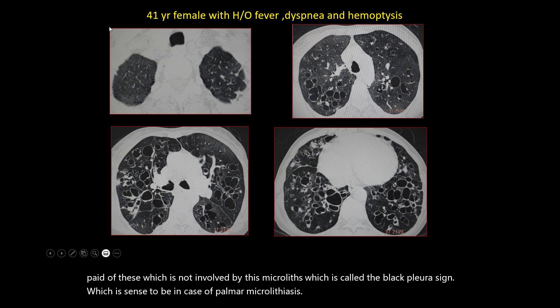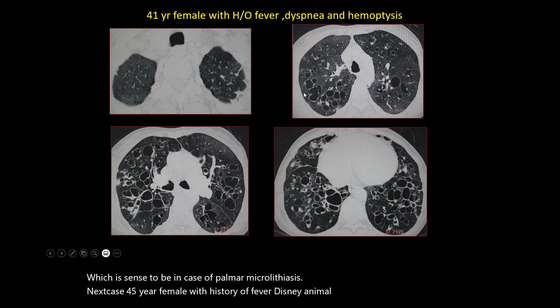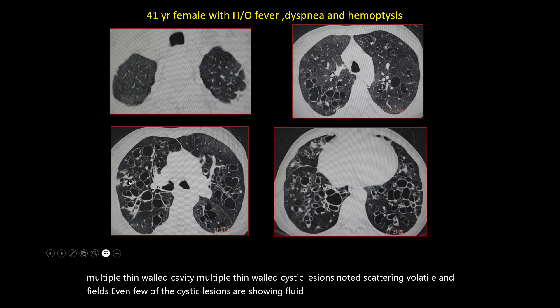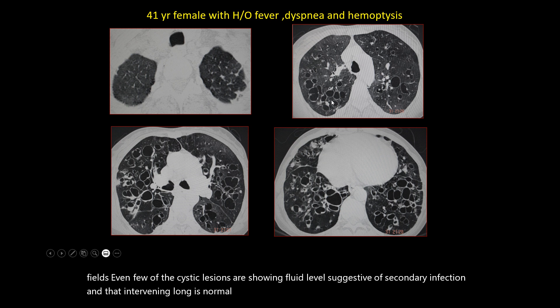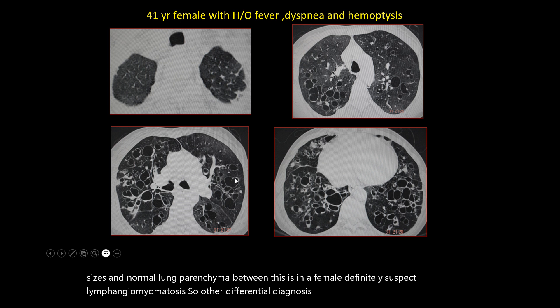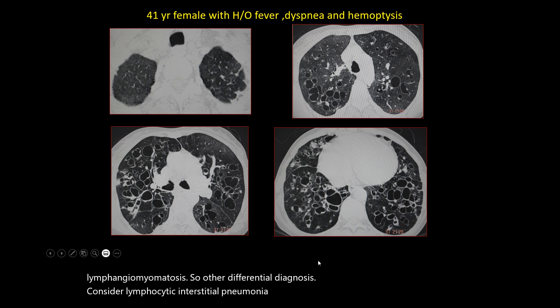Next case: A 41-year-old female with history of fever, dyspnea, and hemoptysis. You can see there are multiple thin-walled cystic lesions scattered in bilateral lung fields. Few of the cystic lesions show fluid levels suggestive of secondary infection, and the intervening lung parenchyma is completely normal. Multiple cysts of nearly equal sizes with normal intervening lung parenchyma in a female strongly suggests lymphangioleiomyomatosis. Other differentials include lymphocytic interstitial pneumonia in females with connective tissue disorders or Sjögren's syndrome.